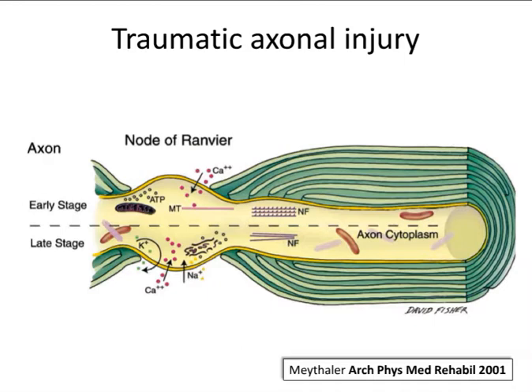So you're all familiar with the pathophysiology of traumatic axonal injury, which has many, many different steps, but which is principally involving a dysfunction of the membrane with changes in ionic fluxes and local swelling. These focal bulbs that occur in the axons are very characteristic, which are then subsequently associated with cytoskeletal damage and ultimately lead to disruption of the axon. So this traumatic axonal injury, which is thought to be a constant feature in TBI of all severities, is exquisitely amenable to identification using diffusion tensor imaging MRI.